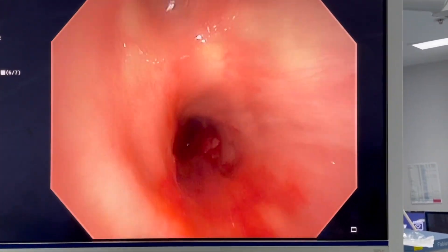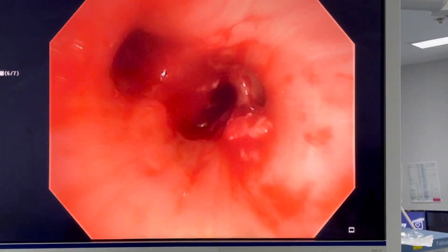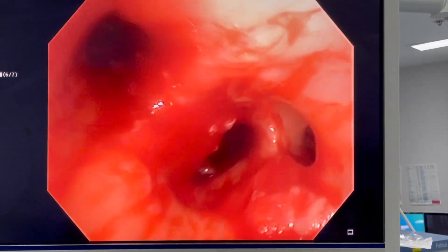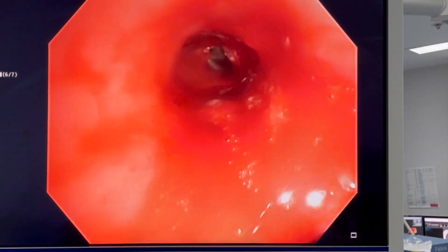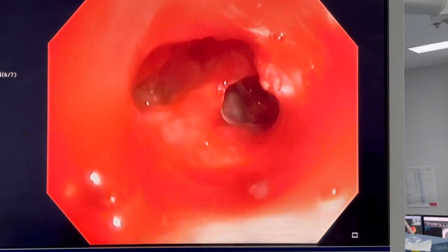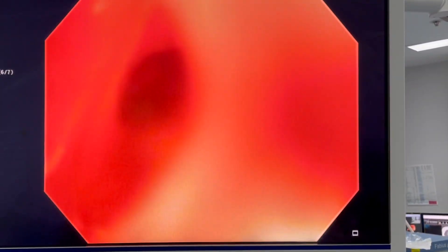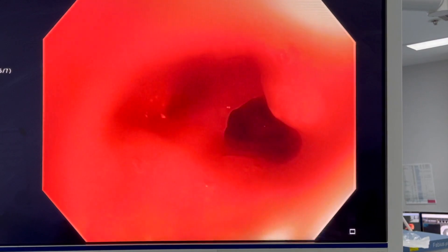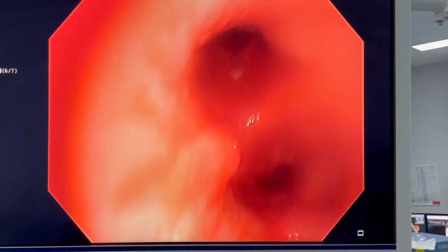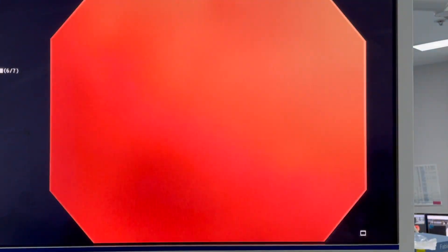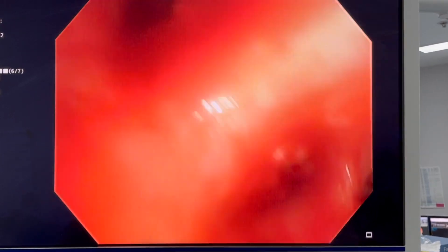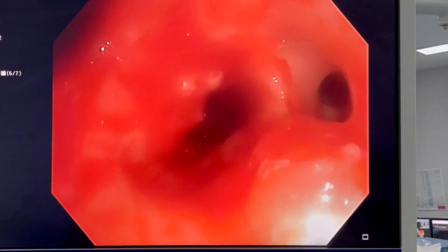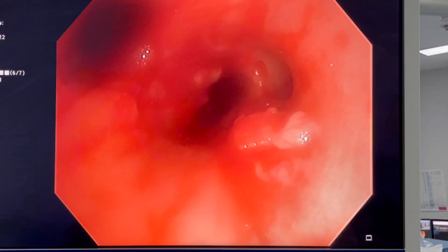Here's the final result once we've cleared out the middle lobe as well. You can see the middle lobe is now patent. There's still some tumour there. The idea is not to remove all the tumour, but to remove the tumour from within the airway to allow patency of the airway. So we get diagnosis but also therapeutic effect.